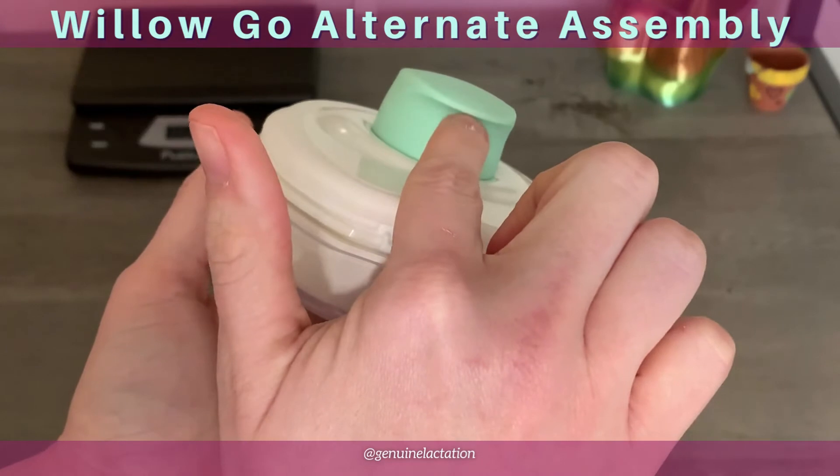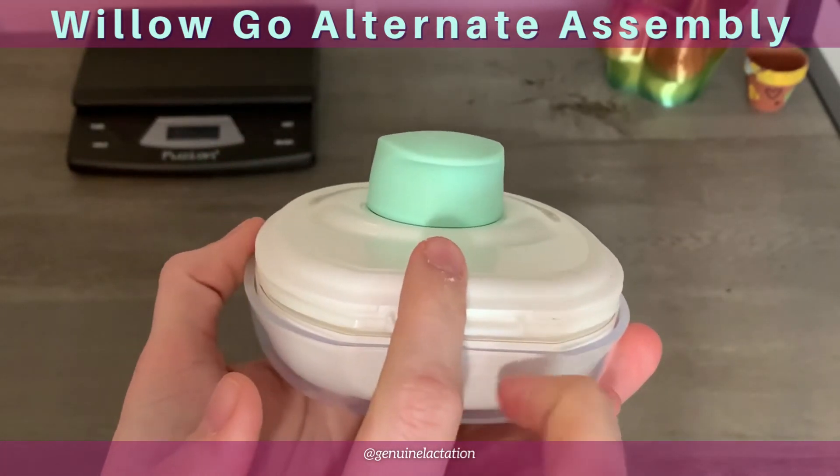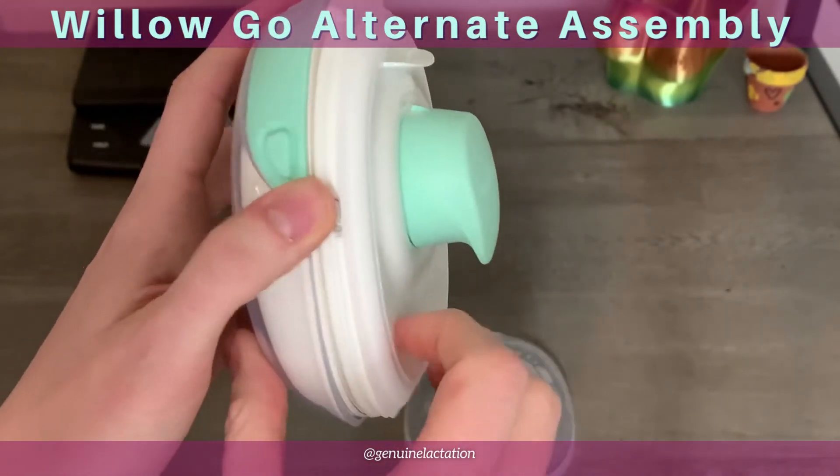If this slit is open when you've assembled it, it's going to create an atypical vacuum. And then when you go to take the pump off, if it's submerged, you're going to get backflow through it.